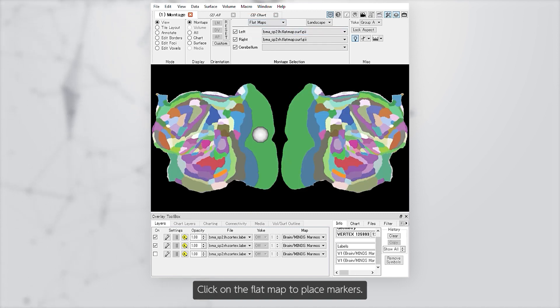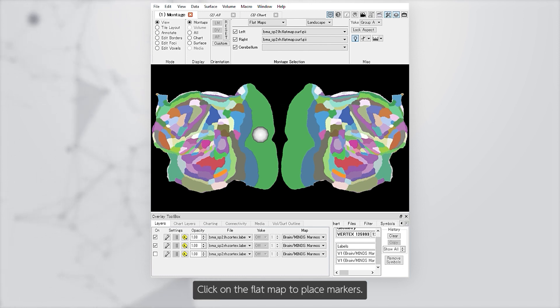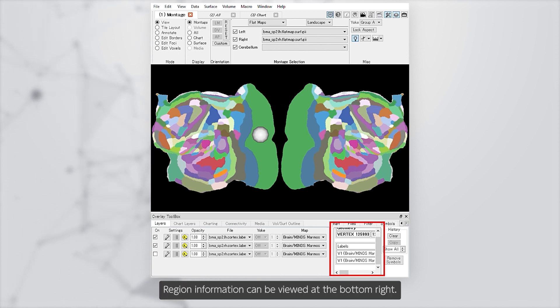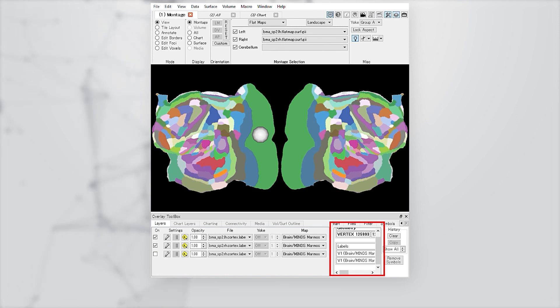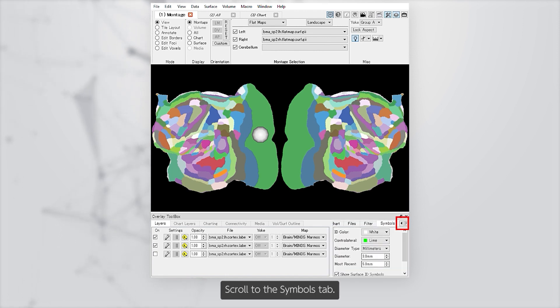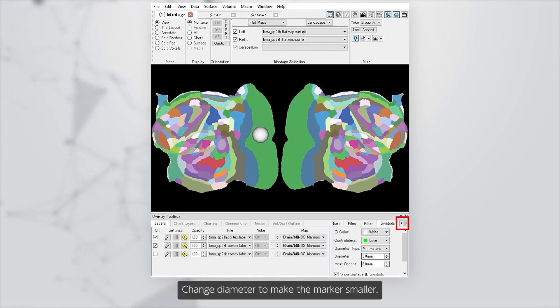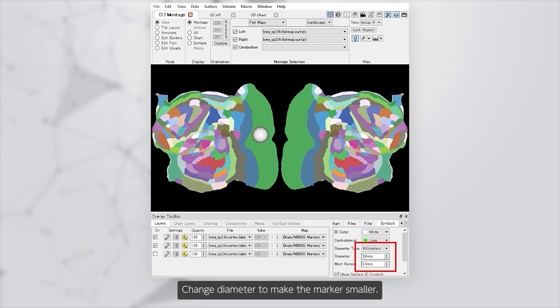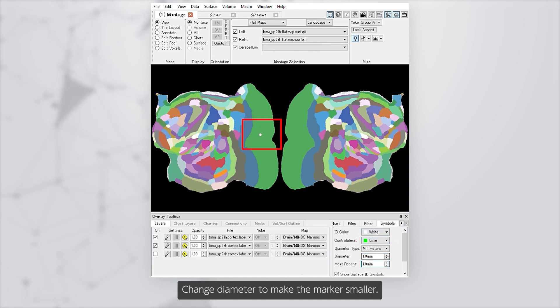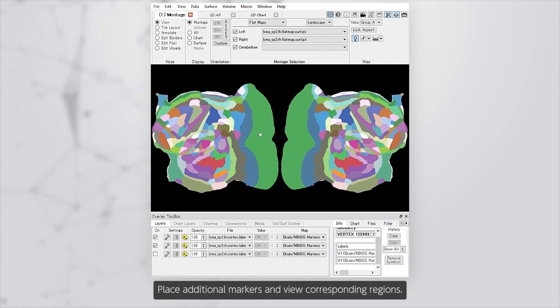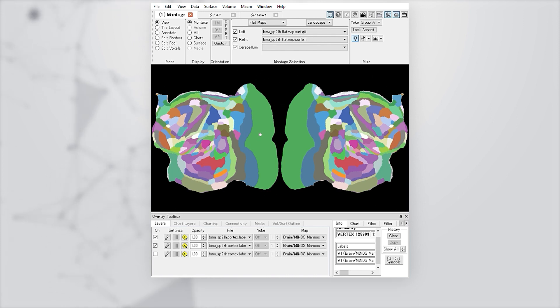Click on the flat map to place markers. Region information can be viewed at the bottom right. Scroll to the Symbols tab and change the diameter to make the marker smaller. Place additional markers and view the corresponding regions.